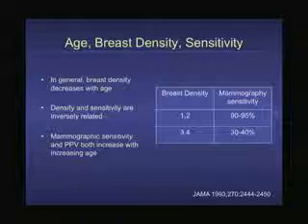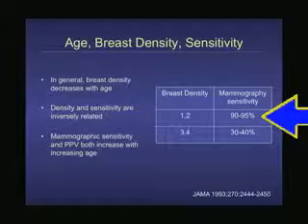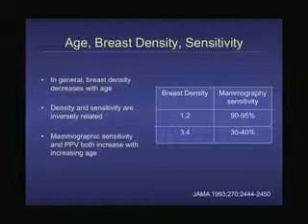What about mammography sensitivity? So again, the likelihood that the exam, mammograms, are going to pick up the disease. Well, we know that breast density and sensitivity are inversely related, right? In those fatty breasts, we pick up disease a lot of the time. It's easy to see. But in those dense breasts, it can be quite low. They've actually shown that mammograms are better both for sensitivity and the positive predictive value with increasing age, likely because there's fatty involution and you tend to get fattier over time.